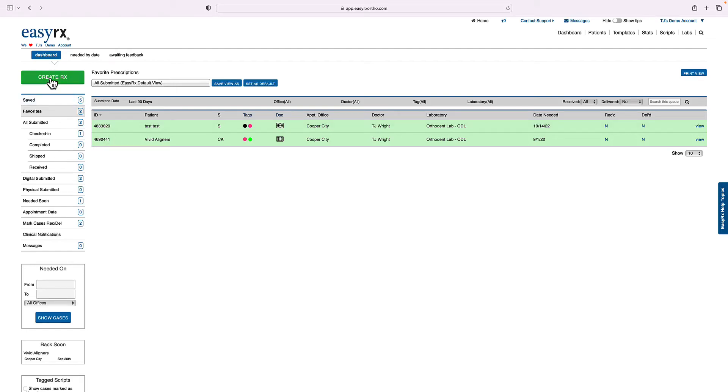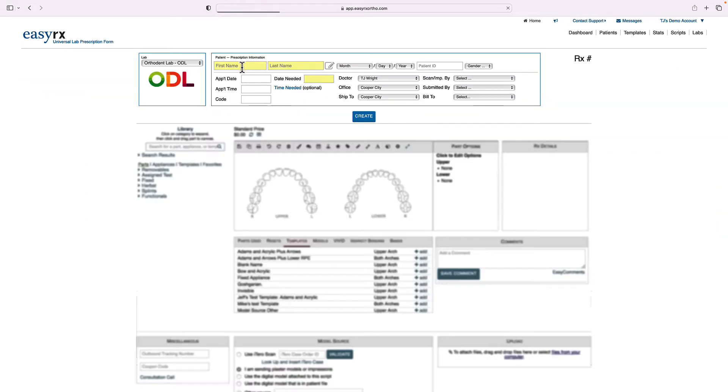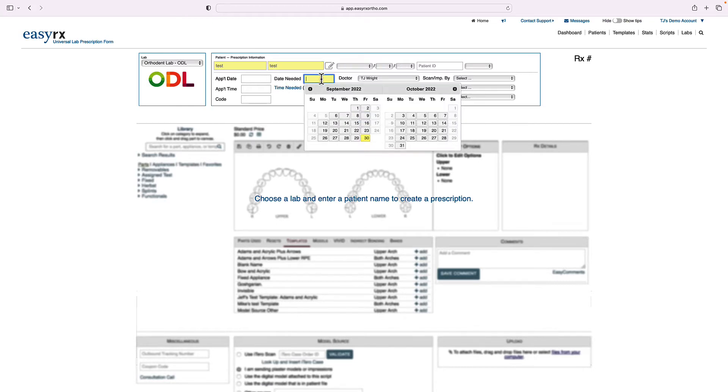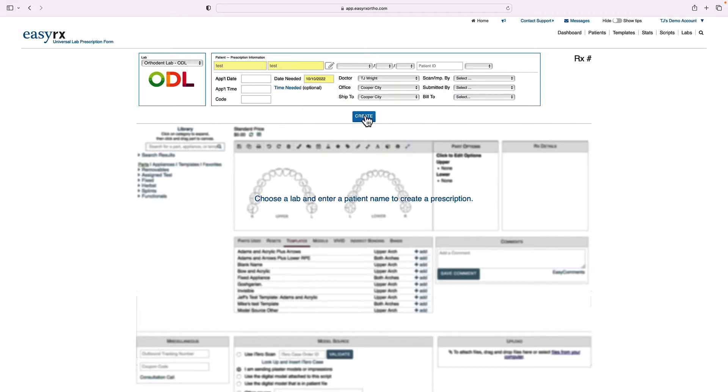Next, we're going to create a prescription for a removable Holley appliance. So back in our home screen, I'm going to click Create Rx, add in patient name and day needed. I'm going to choose a week and a day out, hit Create.